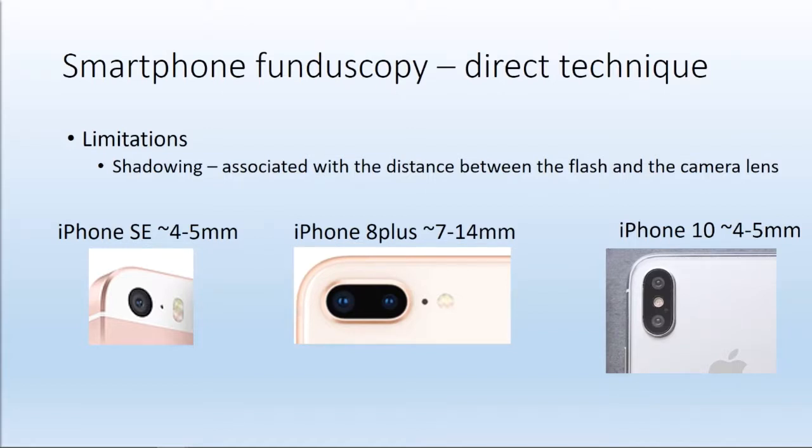So they fixed the glitch. I don't think they're paying attention to this at all right now because there's nothing FDA approved about this. Although I should say, there is a disclaimer from an ophthalmologist that actually studied the light intensity of the iPhone 5 at the time without any tape over the LED flash, just running continuously on the retina.